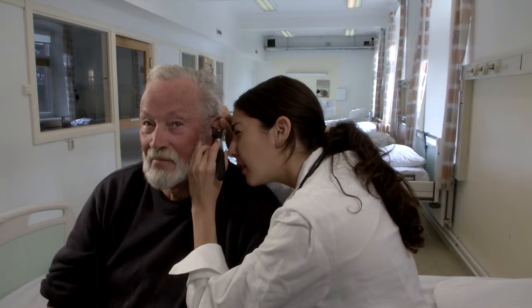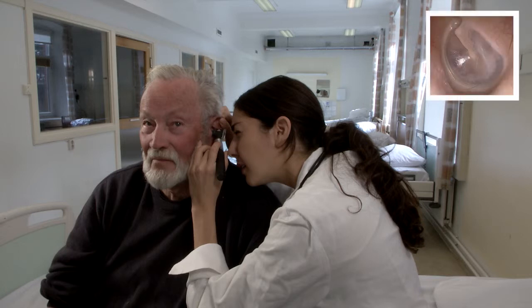With your hand, gently pull up and back the ear. Work gently and quickly to observe the colors of the tympanic membrane in the canal. Look for the cone of light reflex on a pearly gray tympanic membrane.